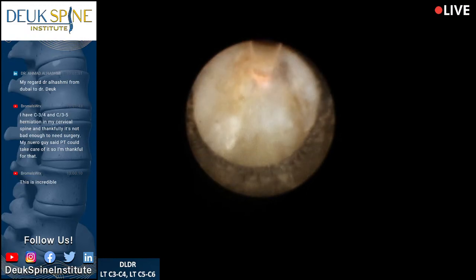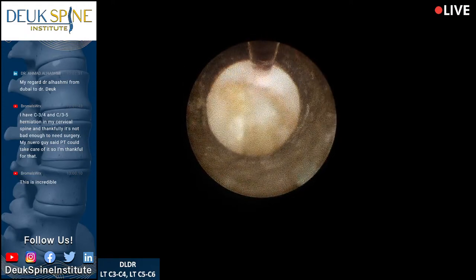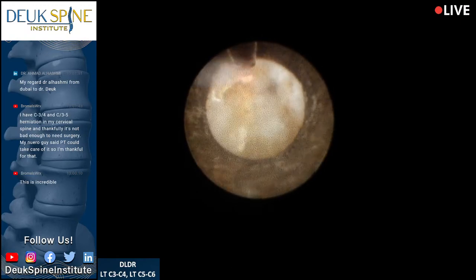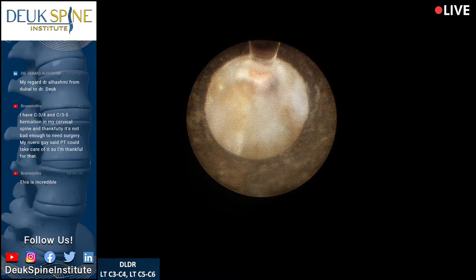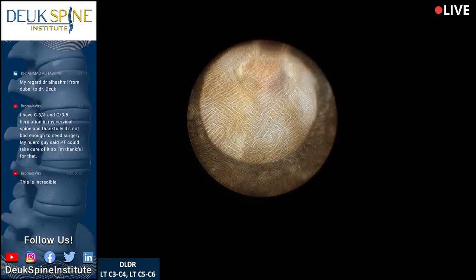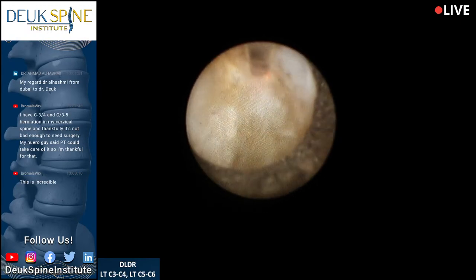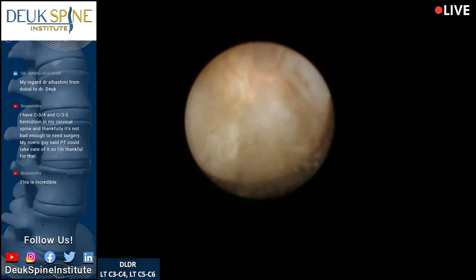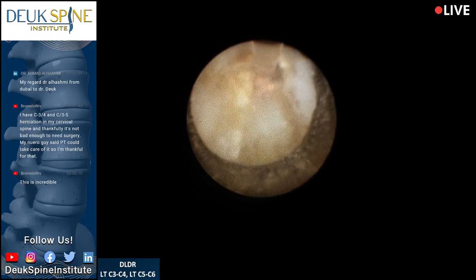We've got just layers of scar tissue. I think this injury is several years old — you don't get this much scar tissue in five or six months; this is years and years of accumulation. The scar tissue gets so thick it acts like a benign tumor putting pressure on the nerves. That's where some of his weakness is coming from — the herniation and the scar tissue created as a reaction to it. That's what we're fixing right now.